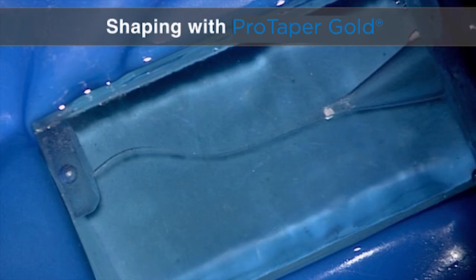Let's look at shaping this canal with ProTaper Gold. Remember, shaping is the most straightforward procedure probably in clinical endodontics, but that's after glide path management. Why do I use a plastic block? A plastic block allows us to look at an instrument and observe when it cuts, where it cuts, and how much it cuts. We could use an extracted tooth, but you would see nothing.